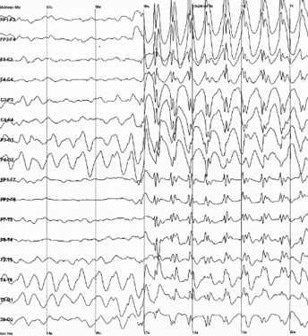When the eyes and eyelids are completely still, this corneo-retinal dipole does not affect EEG. However, blinks occur several times per minute, and eye movements occur several times per second. Eyelid movements, occurring mostly during blinking or vertical eye movements, elicit a large potential seen mostly in the difference between the electrooculography (EOG) channels above and below the eyes.